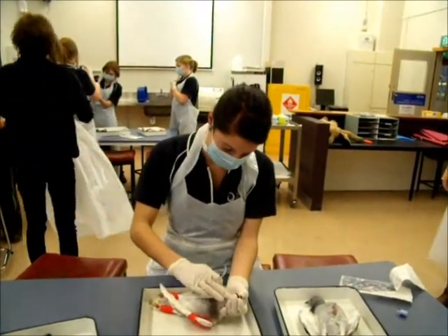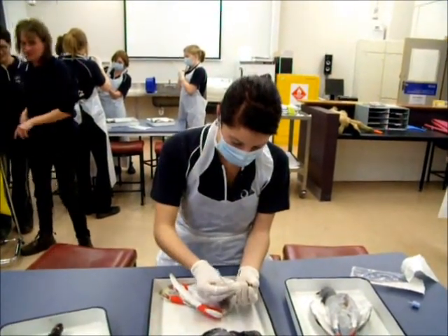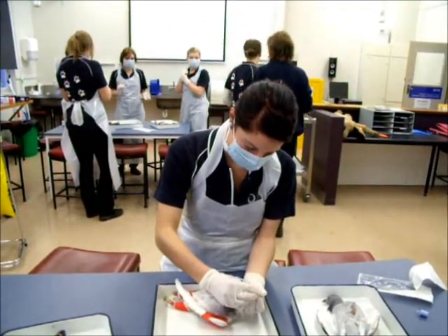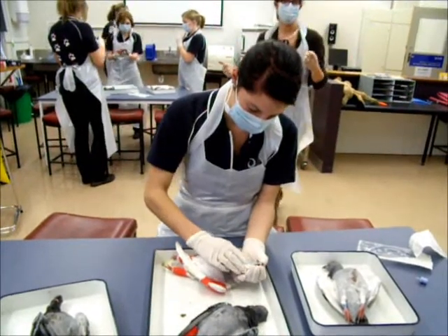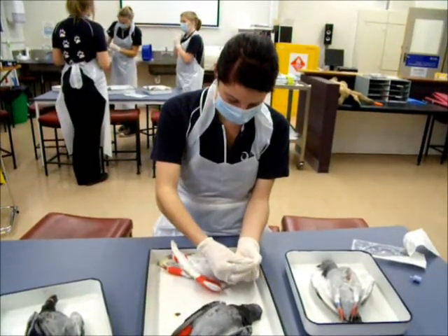I'm going to pop a crop tube down here, just going to check the crop activity by putting it here. We'll start by putting it on the left side, making sure the bird's neck is at the right. You can feel it going down. So put it to the right now and push it down. And you can feel it. So now it's in.